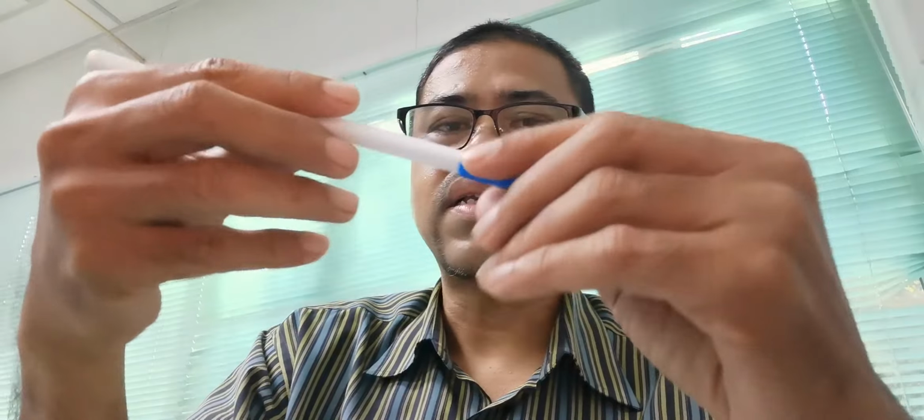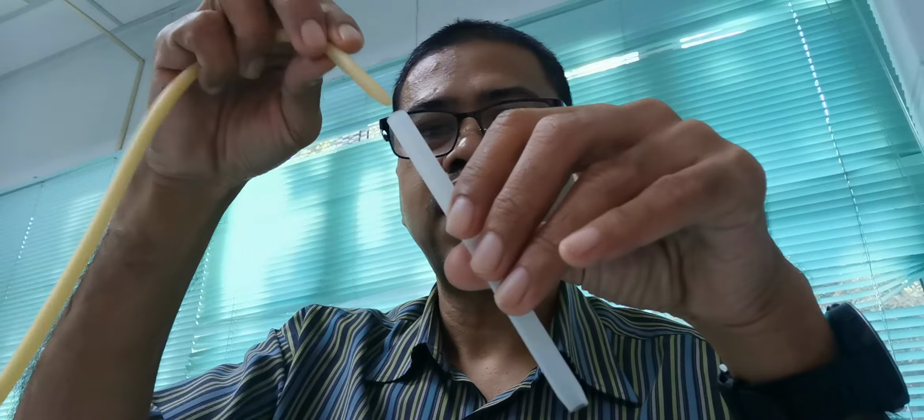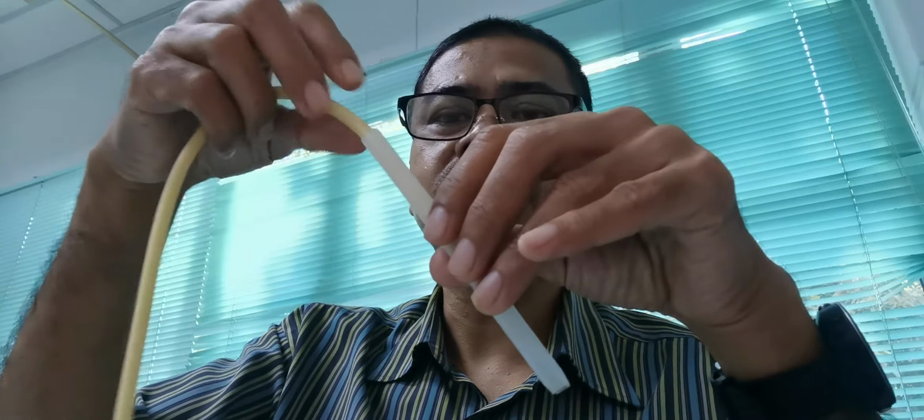This SPC consists of the thick end and the outside trocar where you have the sheath here, and this is the trocar. This trocar will be inside the skin so that you can pass the catheter later on.